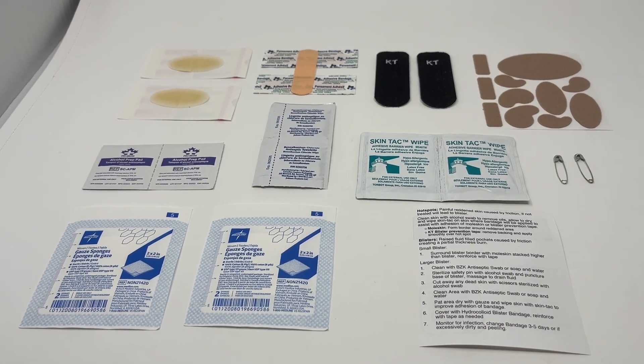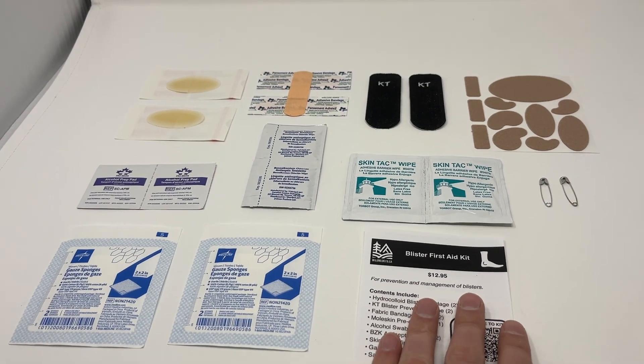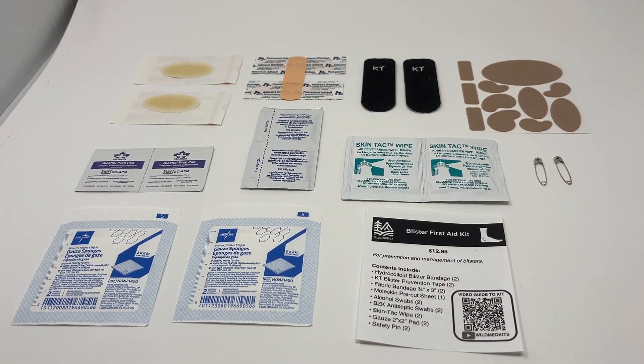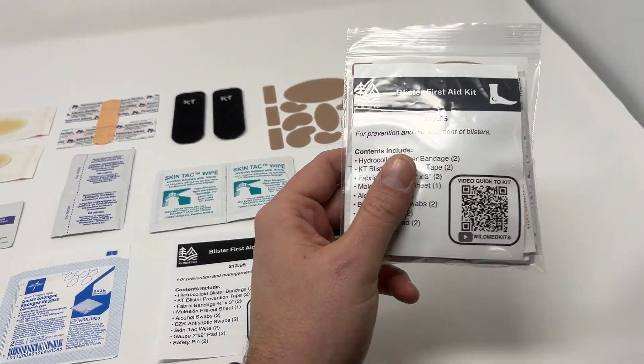We've really thought this through and gone through all the products for you. This is our brand new blister first aid kit — you can get it at wildmedkits.ca and also build your own kit on top of it.